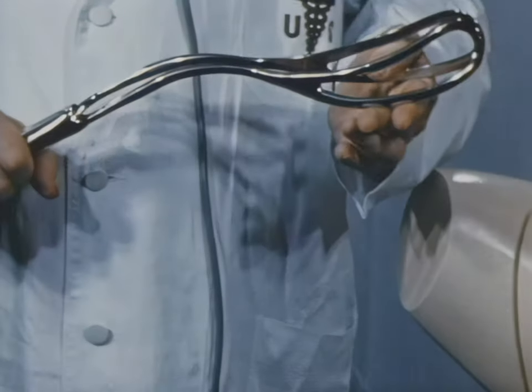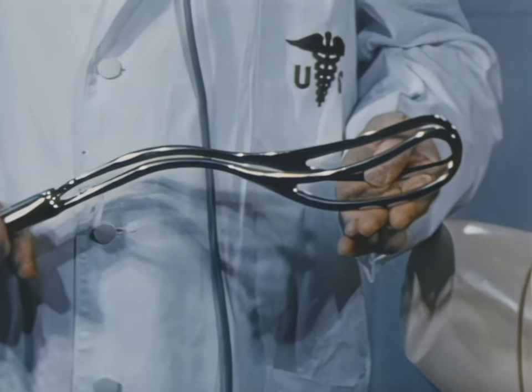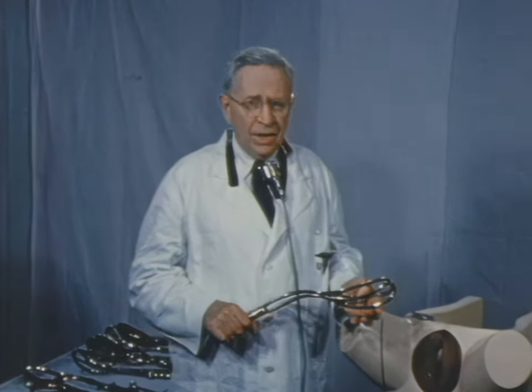Dr. Denon: Thank you, Colonel Reaver. In 1924, the late Edmund B. Piper of Philadelphia presented this instrument, which is intended for the aftercoming head, and is not to be confused with his other instrument, the two-piece axis traction forceps intended for the forecoming head.